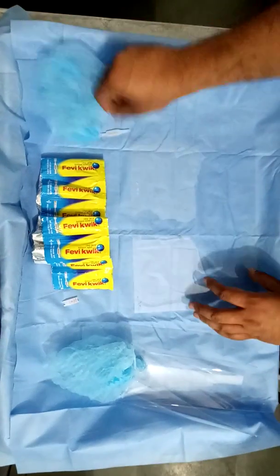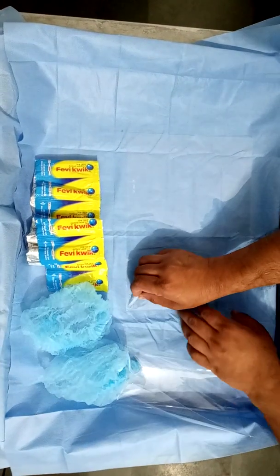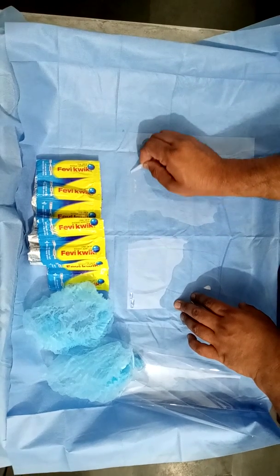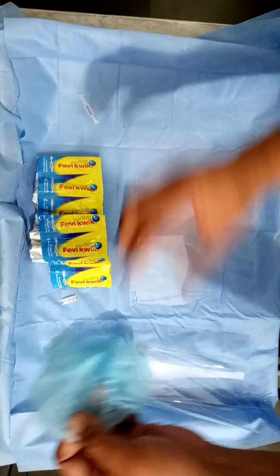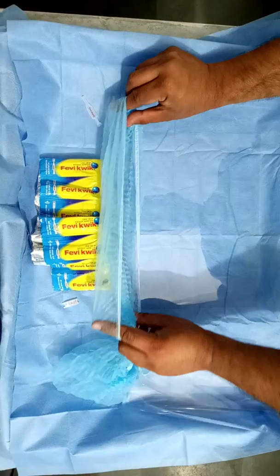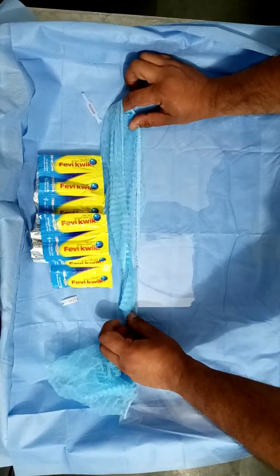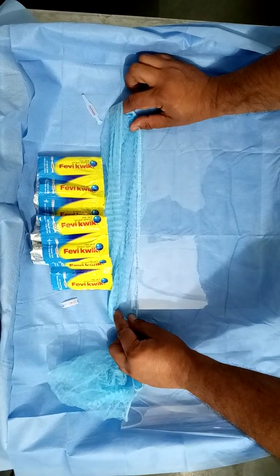What we do is very simple — we apply fevequik to one edge of the plastic sheet, and then apply the surgical cap along this edge. A person can help you tap it down and keep it in place for a bit.